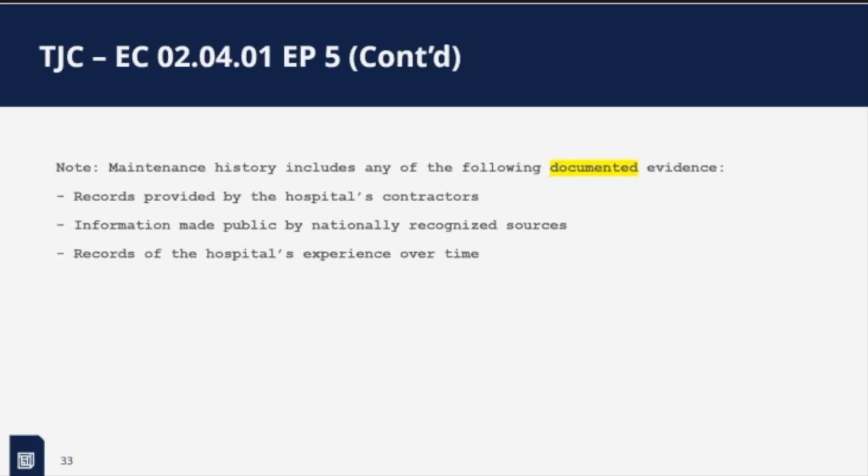If you have all that stuff readily available in your CMS or in binders, we still have customers that have the wall of binders behind them for different things. If it's easily available, you're doing it right in that room, perfect. Just make sure you know where it is, you practice, you know where all that documentation is, and that qualified individual knows where that stuff is too.